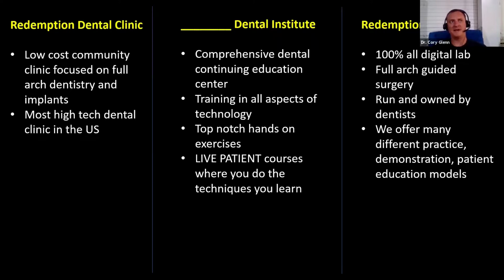Our hands-on exercises are going to be, I don't think, able to be replicated by anyone else, because we are literally going to have all the technology sitting right there. So if we're teaching a milling course, you're going to scan on typodonts that you prepped, and then you're going to design it, and then you're going to mill it. It's a really big focus of ours that we teach you the actual workflows on the real equipment. And then again, live patient courses. We'll have simple implant placement all the way up to complex full arch. All of that stuff is things that we'll be offering.